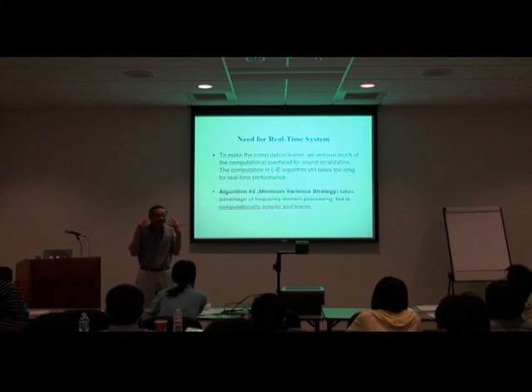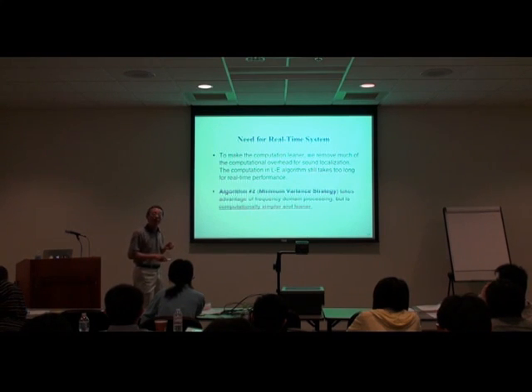We don't have the computation efficiency to process all of the information. Instead, our efficiency is limited to processing one sound at a time. So we thought there was an overkill in the system by doing that kind of heavy computation.